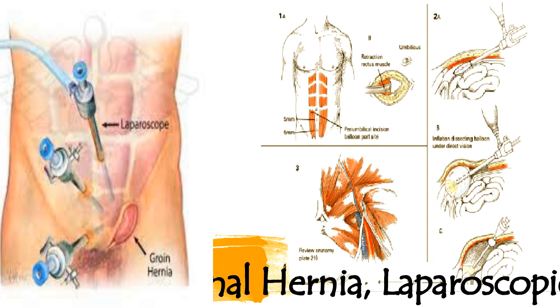Figure 1b. The dissection of this space is facilitated by the use of a 3-component dissecting balloon. This is inserted into the space via the umbilical incision. The bulb insufflator device is used to expand the balloon. During the insufflation, the surgeon monitors the dissection process with the laparoscope, figures 2a and b. The expansion is gradual. It is important to have all the creases in the dissecting balloon flatten out.